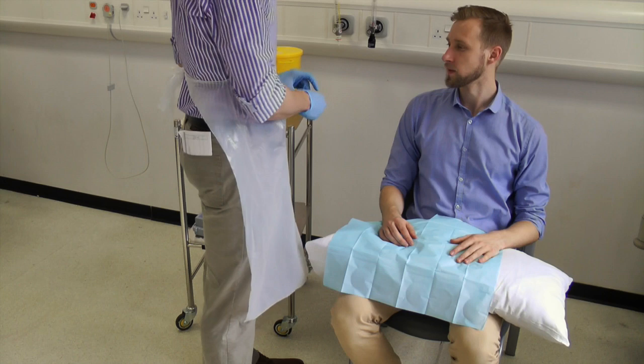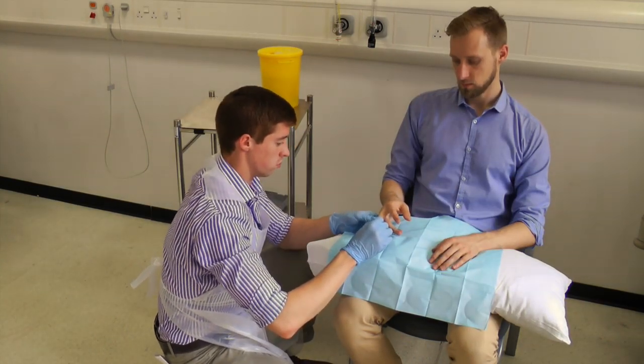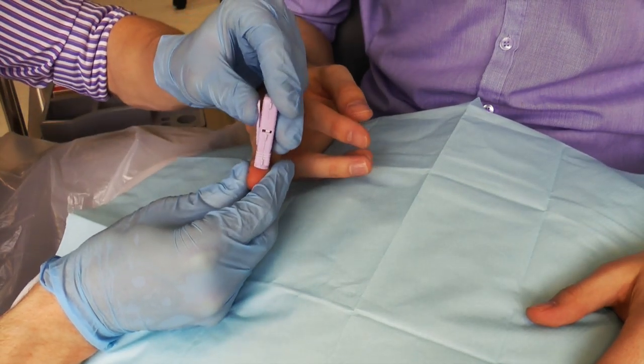Gain informed consent and make the patient comfortable. Clean the skin with soap and water. Warn the patient they will feel a small sting.